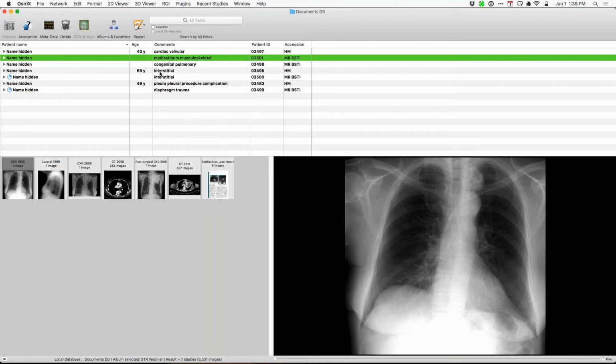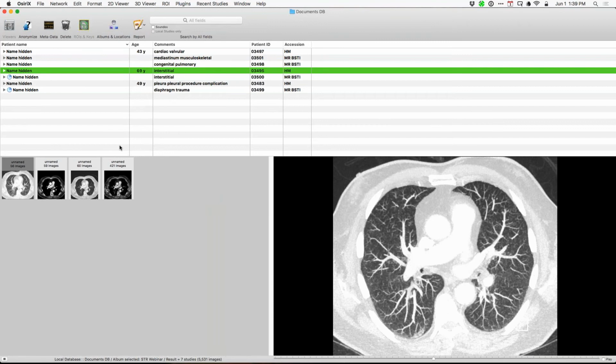All right, well, continue on, Howard. Okay, I'll show this one. I don't have pathologic proof.